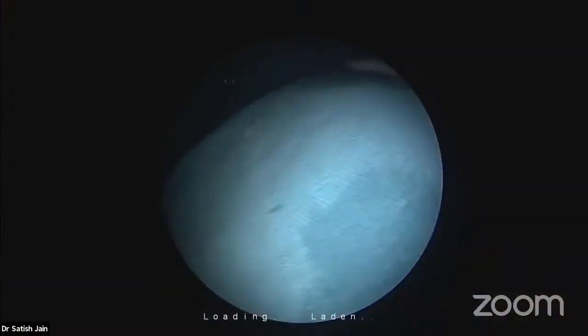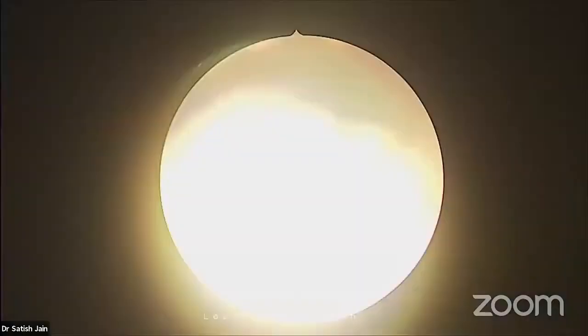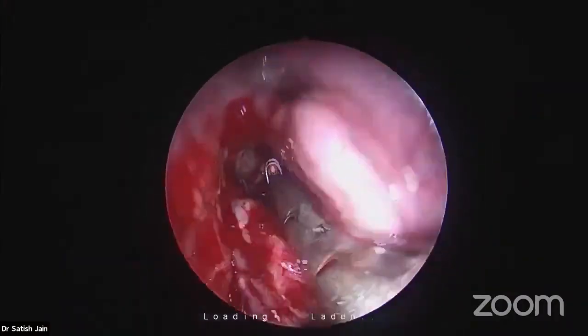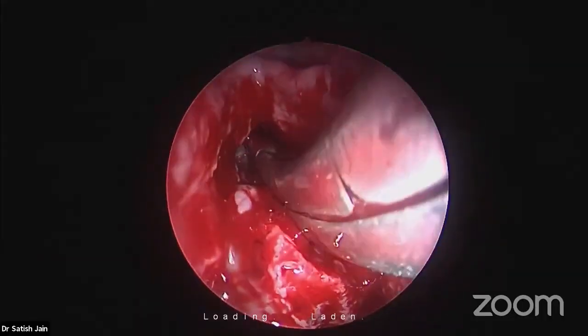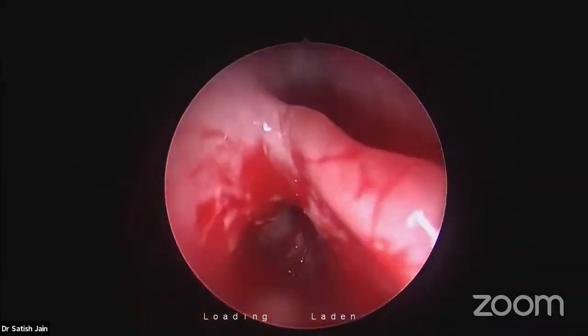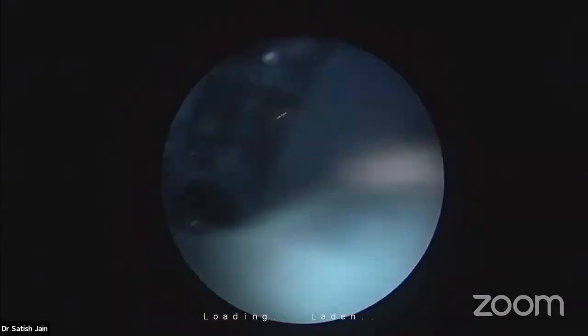I am removing this beak with this special instrument. What kind of a special instrument and what are the curvatures and what is the crossover phenomena during surgery? This is an amazing tool from Karl Storz. See this. See the frontal thoroughly.